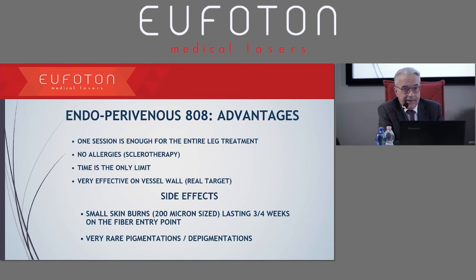What are the advantages of endo-perivenous treatment 808? With one session, if you agree upon this with the patient, you can treat the patient for the entire leg or the entire limb. There are no allergies involved, no problems in terms of quantities to be introduced into the lower limb, like with sclerotherapy. Time is actually our only constraint. I'll have to talk about this with the patient.